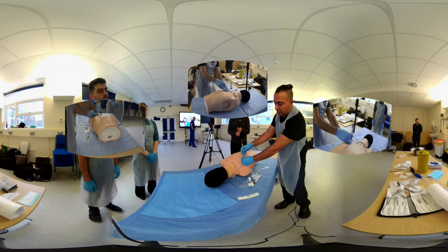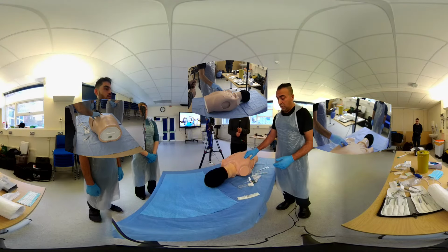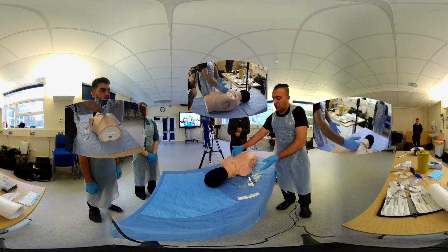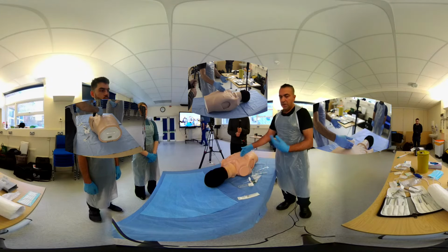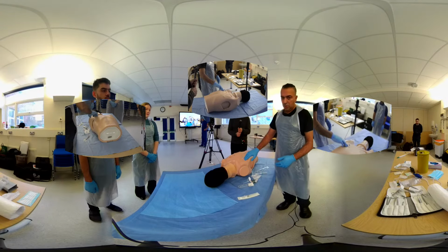Lots of gases coming out, and if you can leave it open, if you wanted to, the patient may regain some consciousness. You have to reassess the patient, go through the ATLS principles. Your tension pneumothorax, where everything on the mediastinum is shifted towards the other side, would now come back more into the mid zone. The patient's vasculature would become more into normality, hopefully, if this diagnosis is correct. But this is where the needle goes.